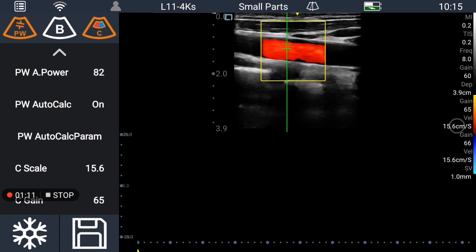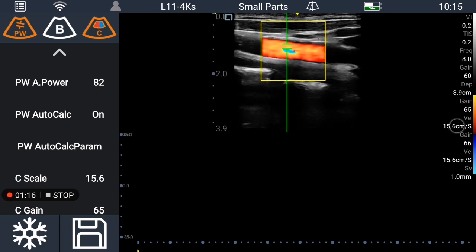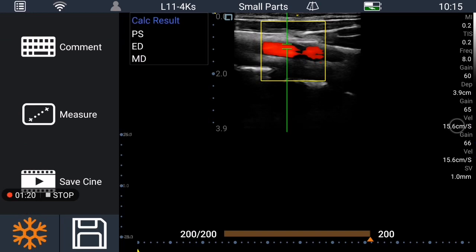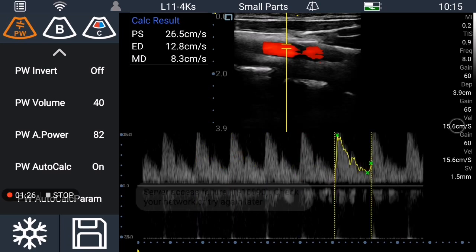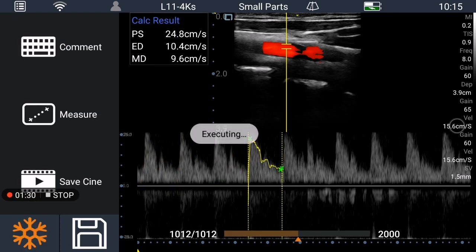Put the pulse wave auto calculation on, and then press the P-DUB function again — it will turn to the auto calculation. That's how it works. You can choose different parameters for the auto calculation.